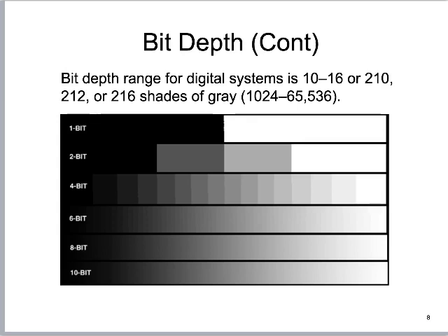So if I were to try to represent it for the human eye, it looks kind of like this. This is a good illustration of what bit depth kind of looks like. Again, it's not a spatial representation. It has to do with how much information can be stored in any one of those little tiny drawers in our matrix, right? So if it has a bit depth of 1, it can represent 2. It's 2 to the power of 1, so it can represent white or black, right? If it has a bit depth of 2, it's 2 to the power of 2, so 4, it can represent 4 colors, right? So we get a little bit of gray in there.